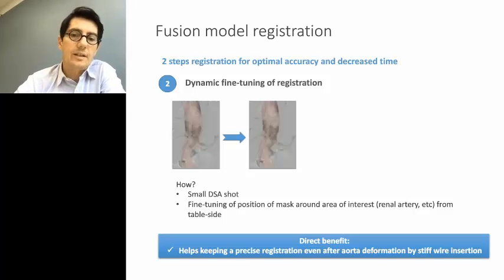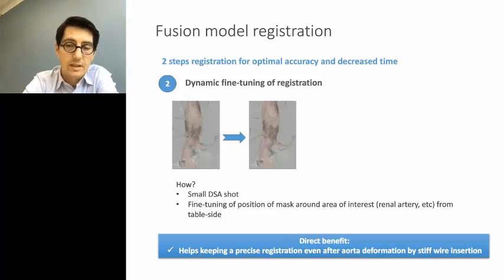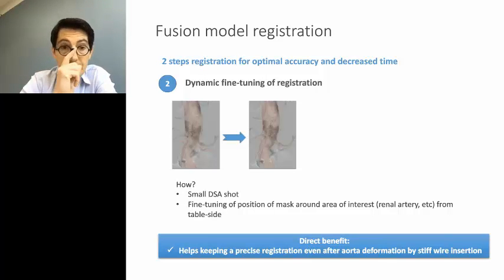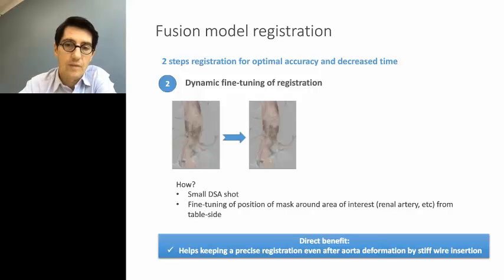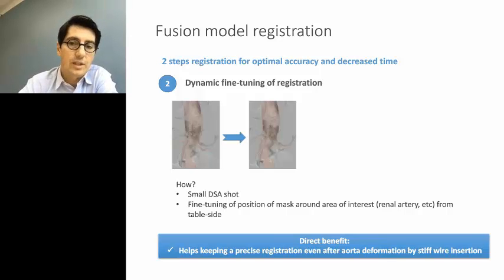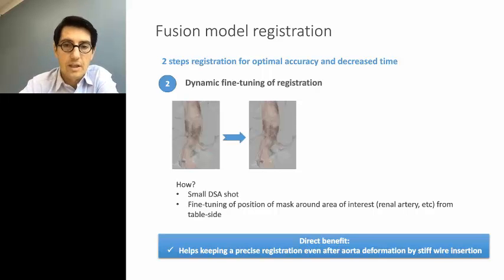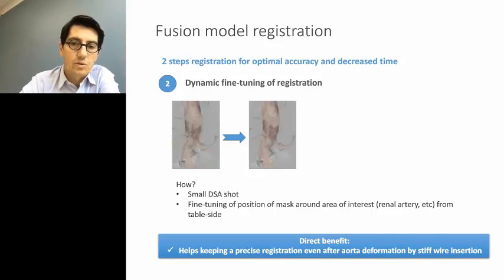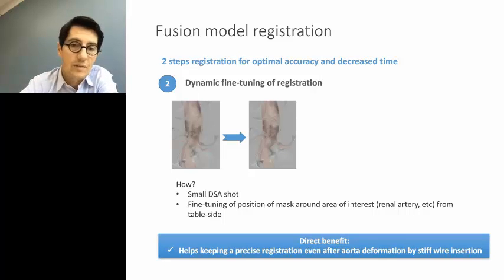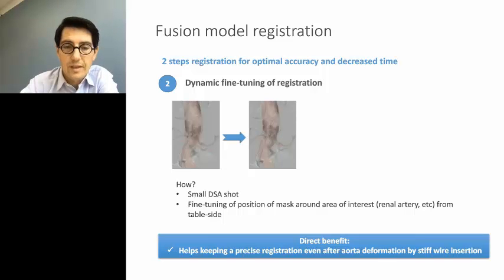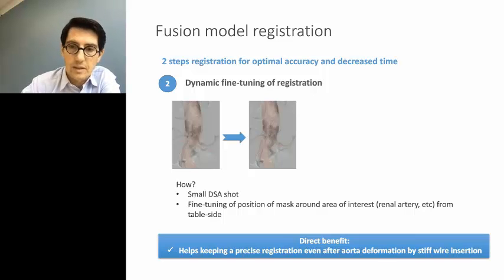You cannot have 100% accurate registration for many reasons — one is patient positioning on the table, another is that we're going to insert stiff wires and a stiff delivery system inside the aortic lumen, which changes the anatomy. The goal is a fast registration using very low radiation dose, performed in a couple of minutes. When you really need to be 100% accurate, you perform a fine-tuning of the registration with a very small fluoroscopic DSA shot using a very low volume of contrast — usually 7 to 7.5 cc of contrast at a high rate — then confirm the fusion mask matches the aorta and its branches on the DSA run.